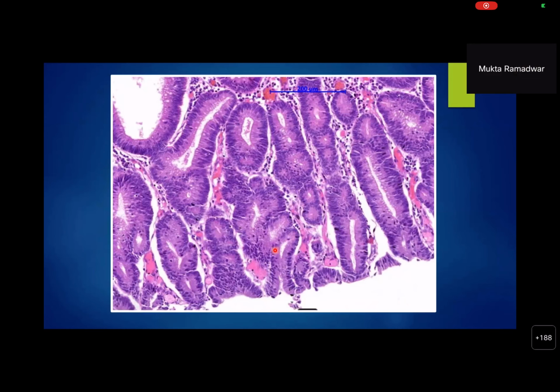Okay, so far your diagnosis is it is a pedunculated epithelial polyp with dysplasia. That means it is an adenoma. Now the next job that you have in hand is to classify it further as to which type of adenoma it is. Okay, it is pedunculated, fine. It has got lots of villous components, so it is a villous adenoma. And now the next job at hand is to say what degree of dysplasia it is.